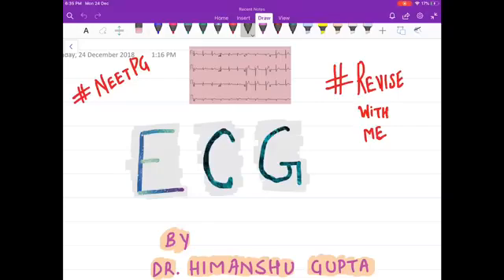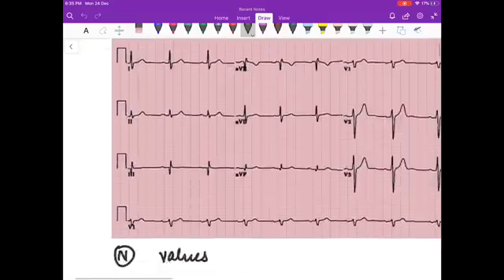I am Dr. Himanshu Gupta and in this video we are going to revise the basics of ECG, the important ECGs that we should know. First, I will be explaining a little about the ECG and then I will be showing you the ECGs. You will try to answer them and then again I will discuss the answers. So let us begin friends.